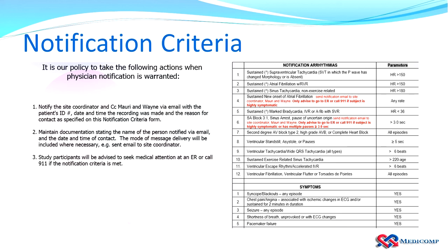The notification criteria are shown here, but you can also reference the notification criteria document that was provided to you. Please note that sustained arrhythmias are defined as a duration of equal to or greater than 30 seconds. Triage actions will not be taken if we have been notified on a patient-by-patient basis that certain arrhythmias are chronic for that patient. The ATR Deep AF pivotal trial does not require a follow-up recording. Study participants should be advised by the site coordinator that the CardioPal Savvy CT monitor is not to take the place of them seeking medical attention if needed.